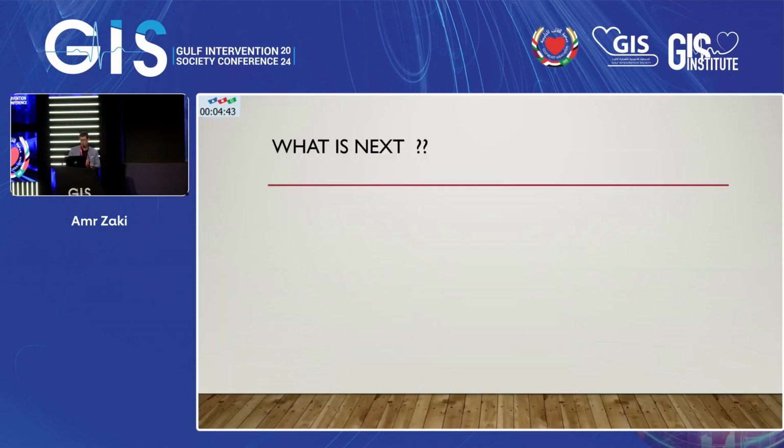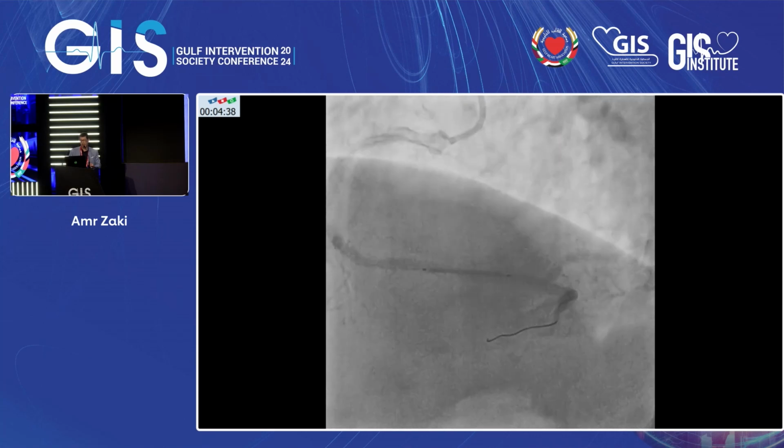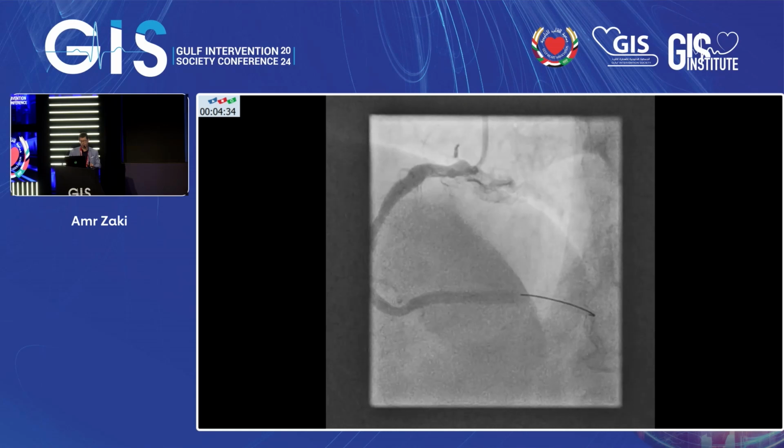It's okay. After that, of course, this is the diagnostic catheter. It's so simple. Go and do direct stenting. It appears fresh, no need for anything. And this was the final result.